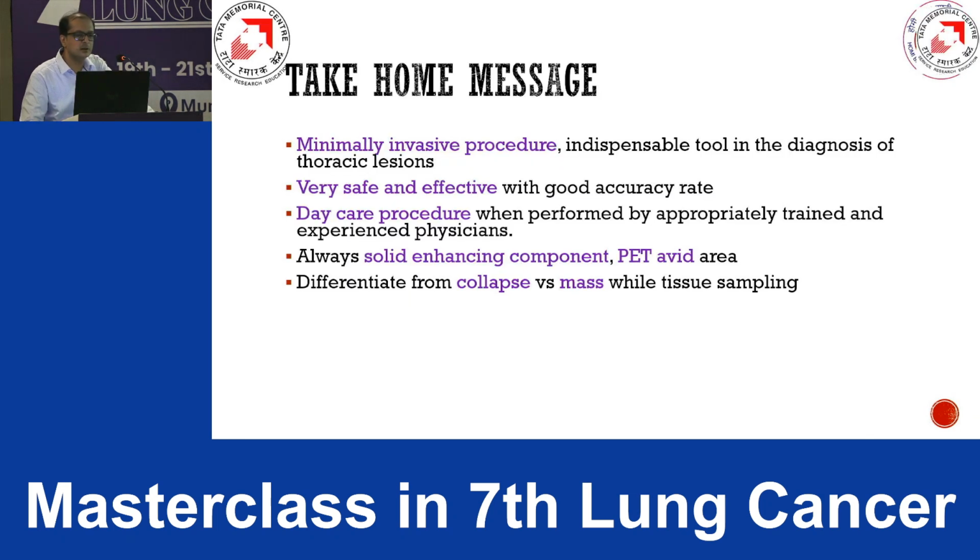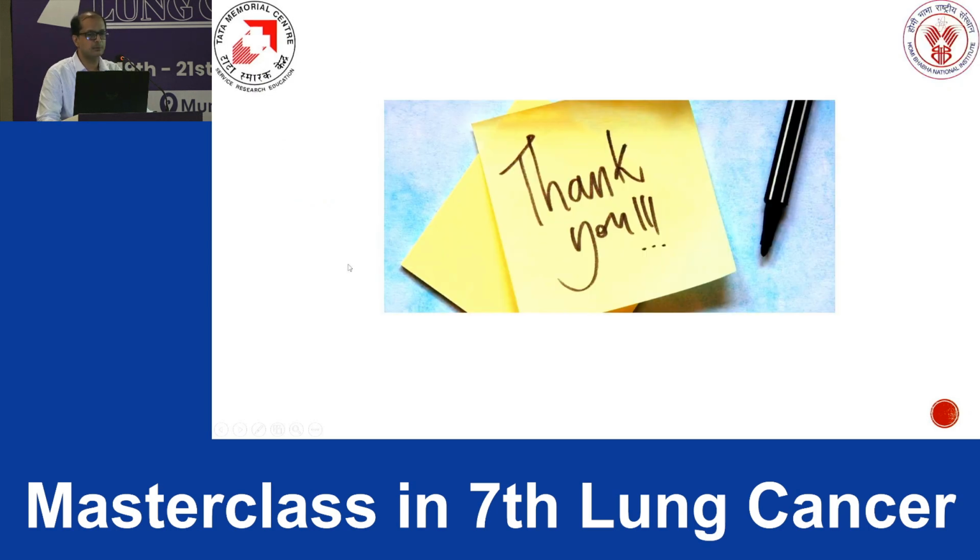And the last slide, take home message. Biopsy is a minimally invasive procedure. It is an indispensable tool in diagnosing thoracic lesions. It is very safe, it is effective with a high degree of accuracy. It is a daycare procedure and can be performed by a trained and experienced physician. Always we need to target a solid enhancing area, PET avid area. We need to differentiate collapse of the lung from the mass while tissue sampling. Thank you.